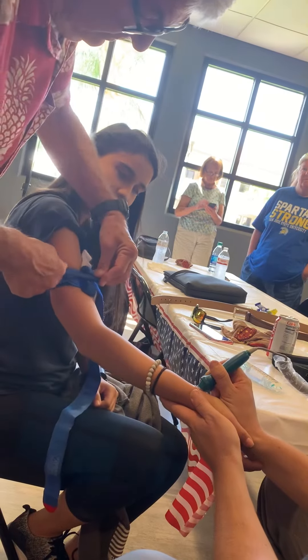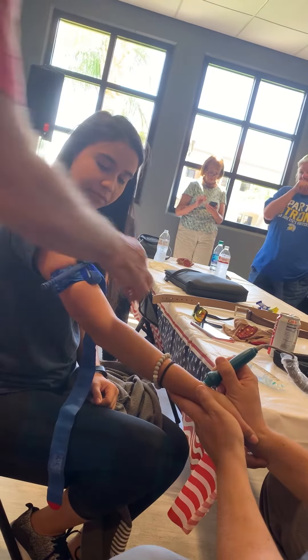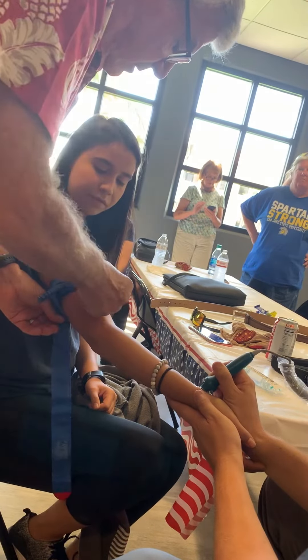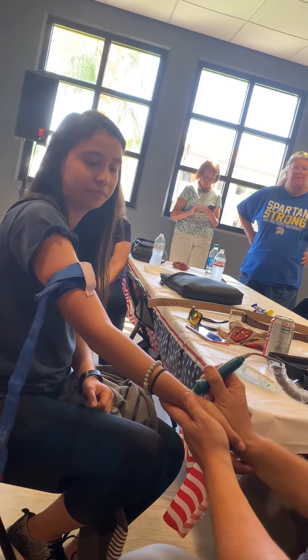There you go — put that velcro piece above it, then the little white tab. We would mark the timestamp here, but obviously you can hear there's no pulse. Great job!